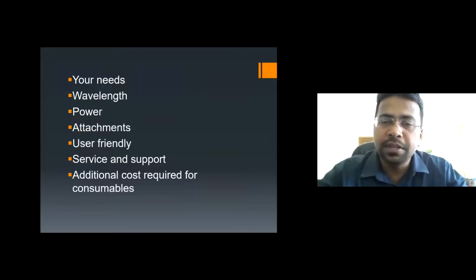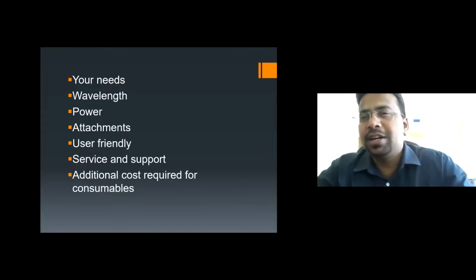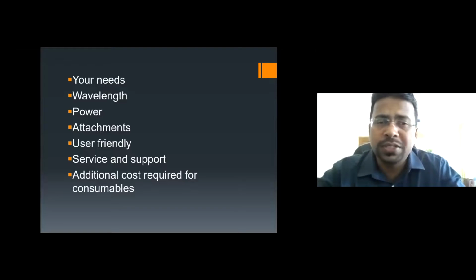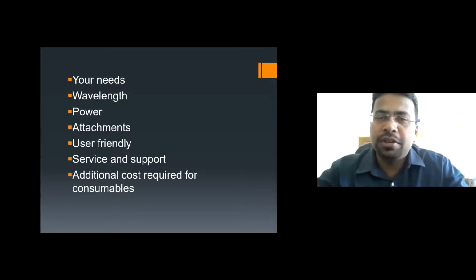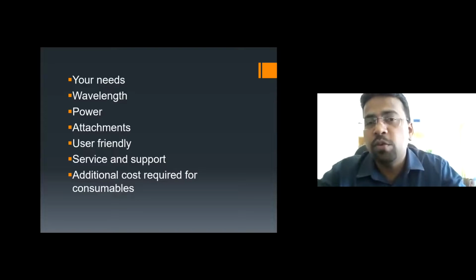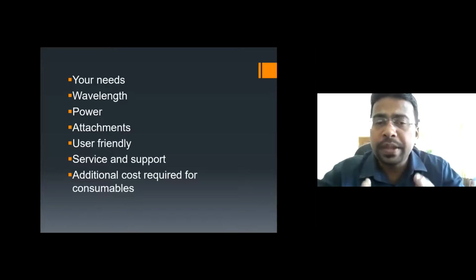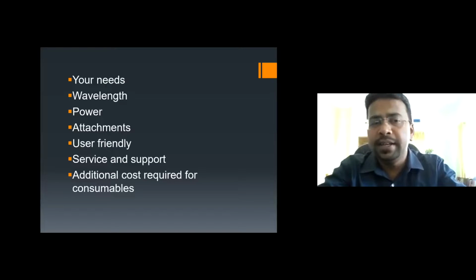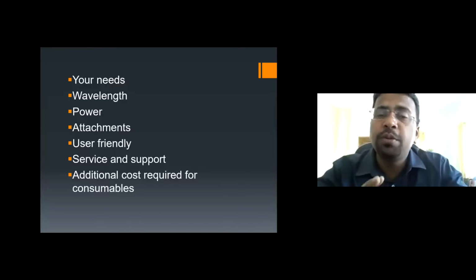The company person will claim that the higher the power, the higher the cutting efficiency, but don't trust them guys. They are the salespersons, right? They want to sell. Okay, so all the intraoral surgical procedures which we perform can be done with a 4-watt laser also. Then attachment, you should ask the dealer what all attachments they are going to provide along with the lasers.